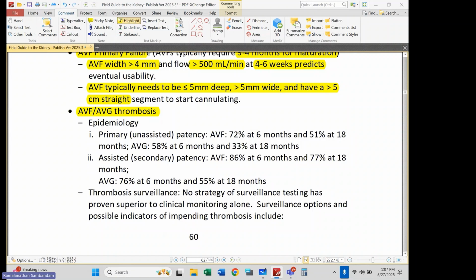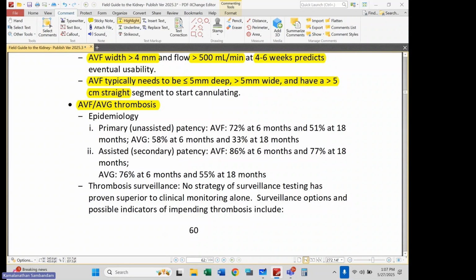Many times it's done, but I want to tell you that you should start developing your skill as a practicing nephrologist so that when you see that patient in the dialysis unit who hasn't made it to their surgical appointment, you're not saying, oh well, we can't access you because we haven't gotten the blessing from the surgeon. You should be able to say, we're ready to go. That looks good. Let's go. Okay. And you don't have to send them for an ultrasound before making that call in the outpatient unit.